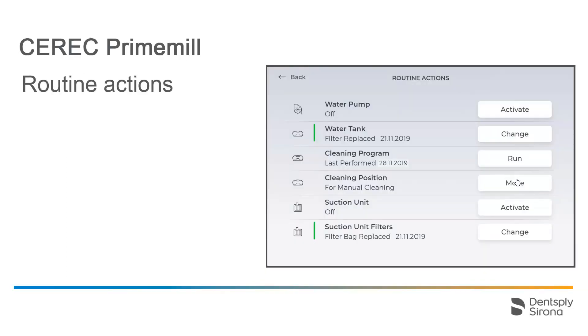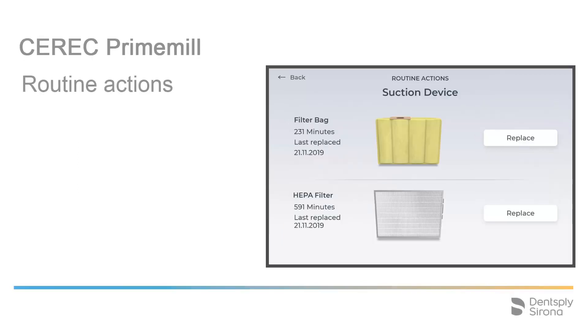Back in the Routine Actions submenu, we will explore the Change Suction Unit Filters option. A colored marking will also alert you to the condition of the filters and whether they need to be changed. We tap Change. This will display information about the two filters mounted inside the suction device, such as the length of use and when the filter was last replaced. The process for changing the filter bag and the HEPA filter is shown in our video tutorial titled Filter Bag and HEPA Filter Change.